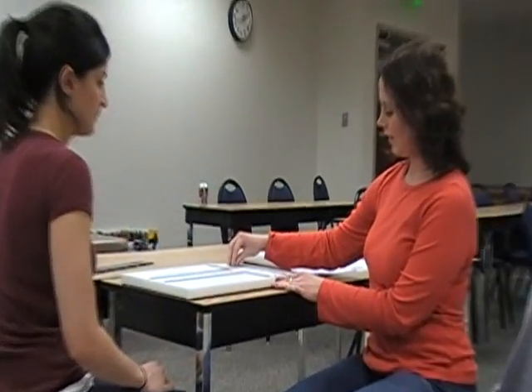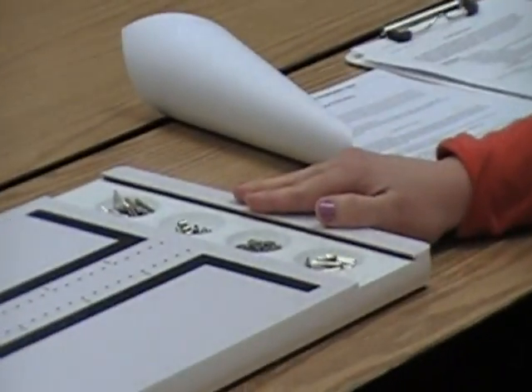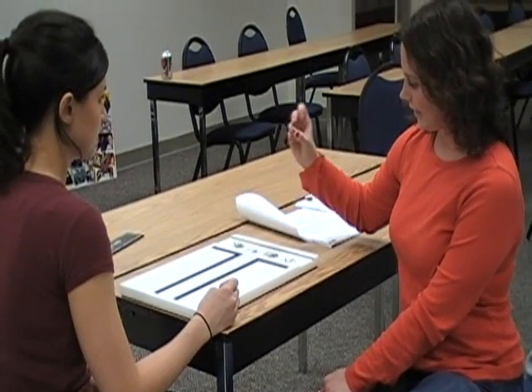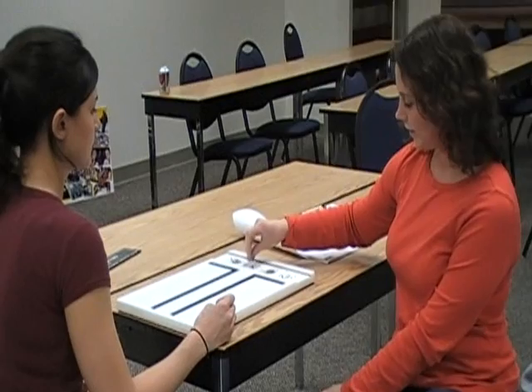Today we're doing the Purdue Pegboard Test. You want to start with the client in a comfortable position directly in front of the board. You want all the cups to be at the top of the board with 25 pegs in the left and right cups. If the client is right-handed, you want 40 washers on the right side of center and the collars on the left side of center. Switch that if they're left-handed.